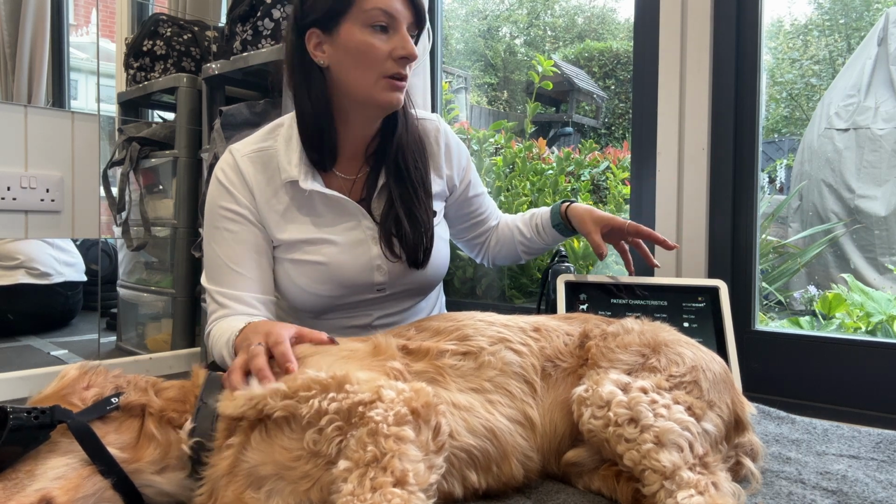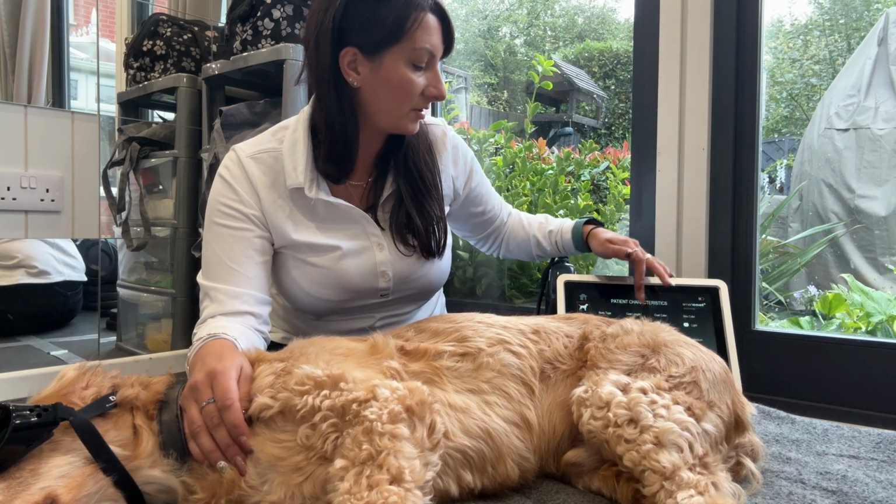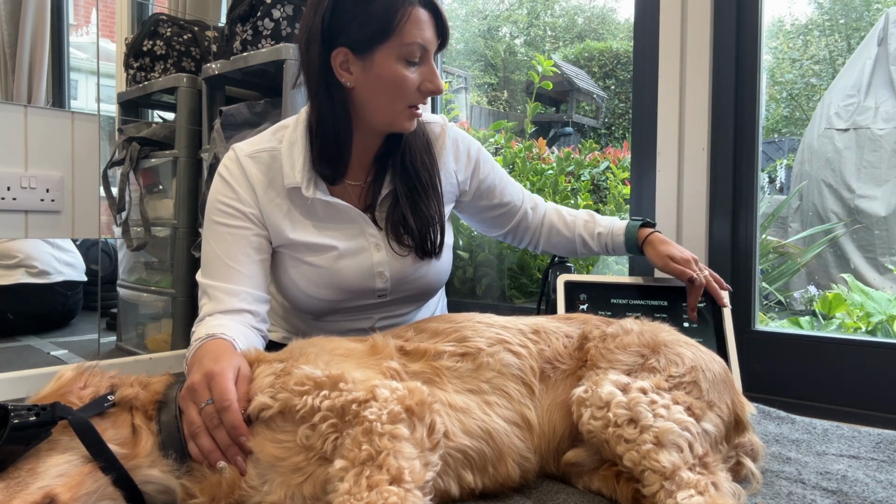So when it comes to actually physically treating, like we say, in a lot of different machines, they're going to have some form of preset protocols. So how heavy is the patient? What's the body type? What's the coat length? What's the coat colour? And what's the skin colour?